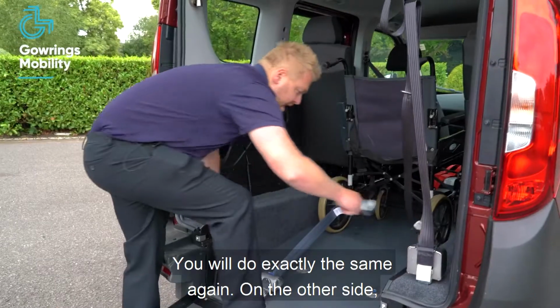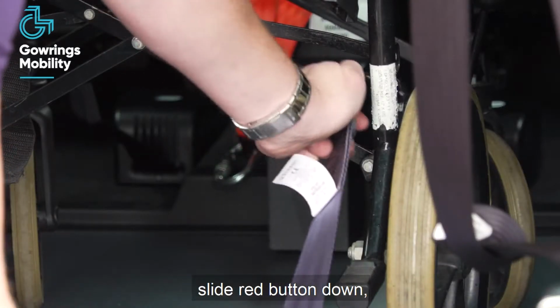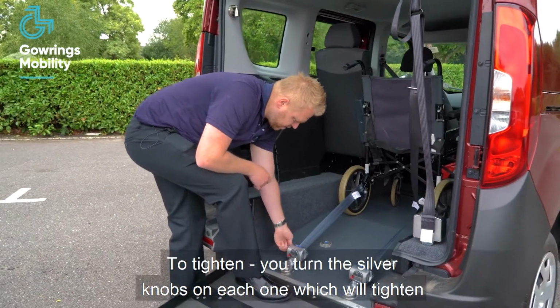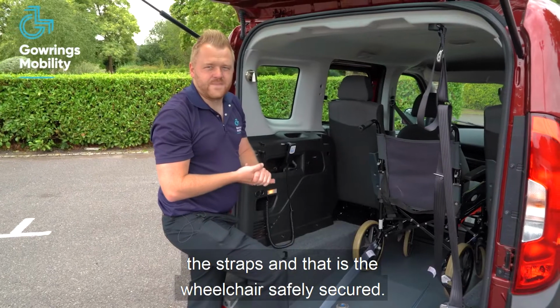You will do exactly the same on the other side, 3 o'clock angle, slide on, red button down and clip it onto the wheelchair. To tighten, you can turn the silver knobs on each one, which will tighten the straps, and that is the wheelchair safely secured.